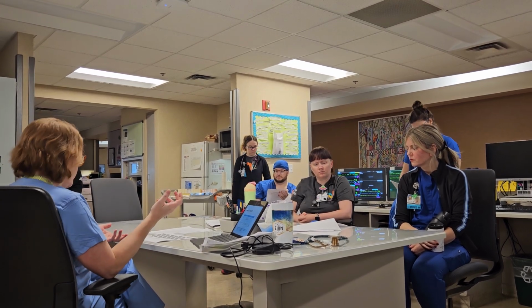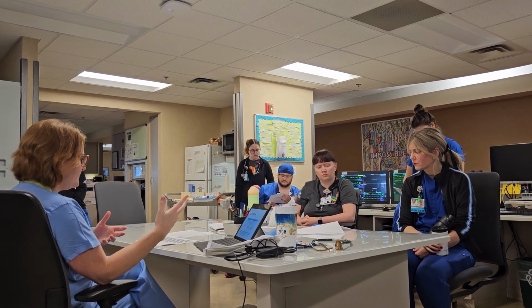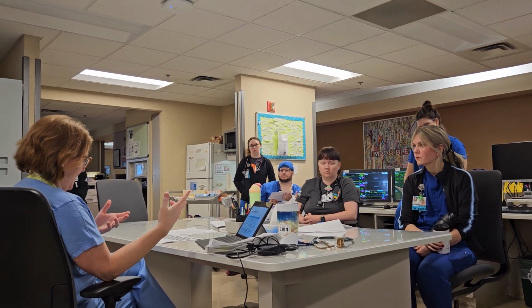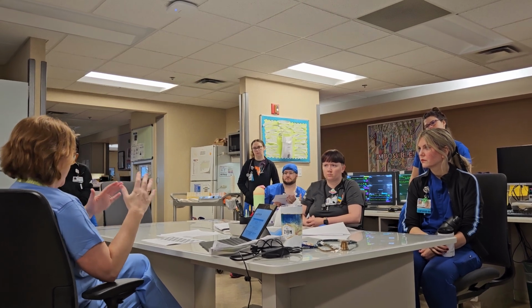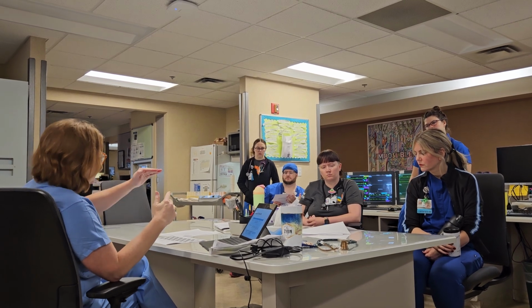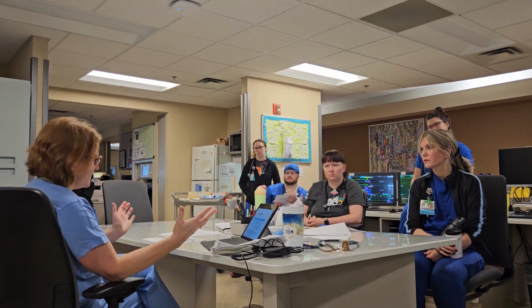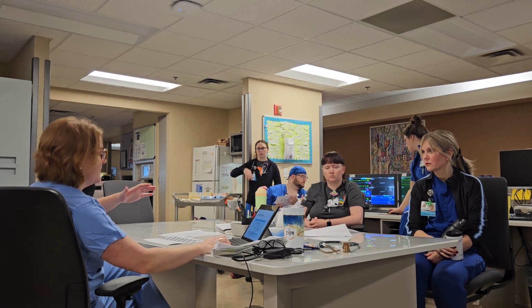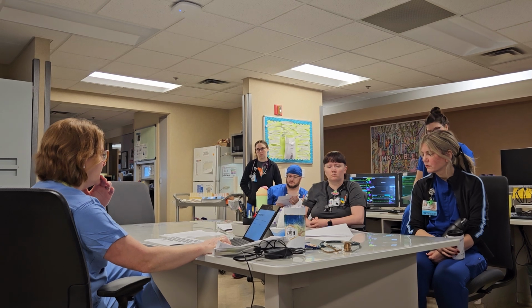And then there's AVAPS, which is a newer setting. It stands for Average Volume Assured Pressure Support. This is basically BiPAP, but it's a little bit more sensitive in that it's adjusting the airway pressures to still target that tidal volume. So instead of setting the pressure that we want the BiPAP machine to deliver, in AVAPS we can set a target volume, similar to assist control on the ventilator. And then the machine, the Trilogy usually, will adjust the pressure to deliver that targeted breath.